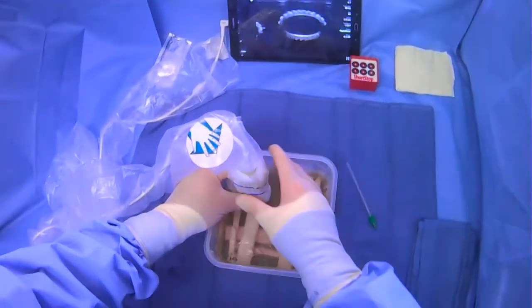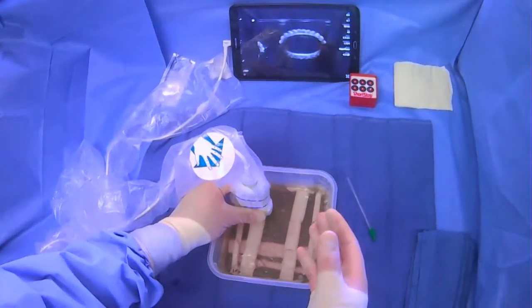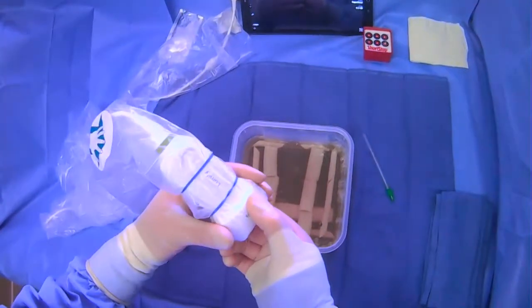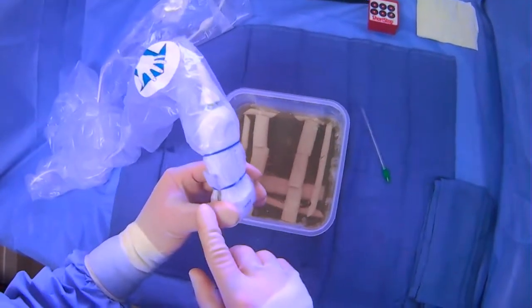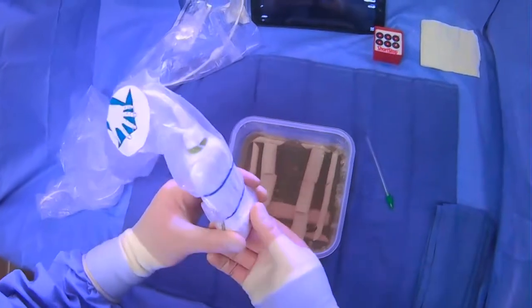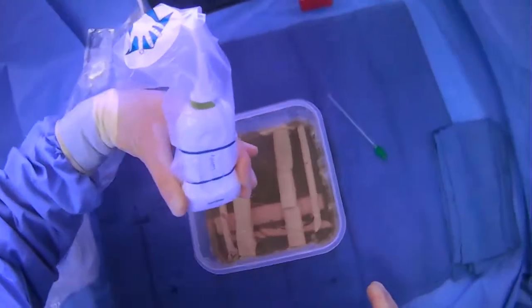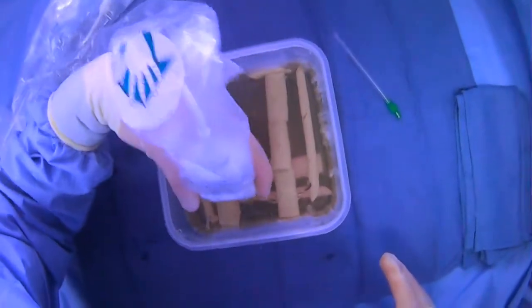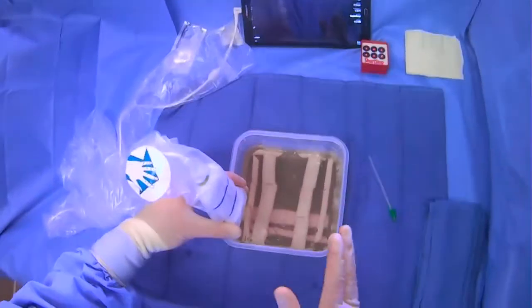However, it is worth thinking a little bit about repositioning yourself and the ultrasound machine to give yourself opportunity to puncture in a different way. So for example, if you are doing this type of a puncture, it can be useful to actually hold the probe like this. You can have your thumb on one side and then your index and middle finger on the other. You can support yourself here, but you can actually scan like this. However, you can see that if we're standing this way, it's really not practical. You kind of have to do something very uncomfortable with your wrist to be able to do this.